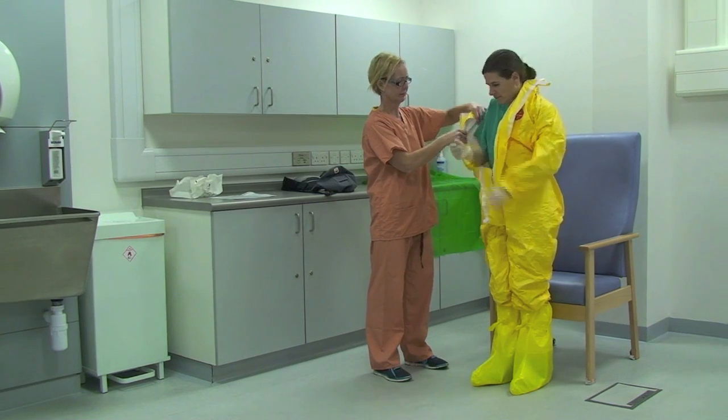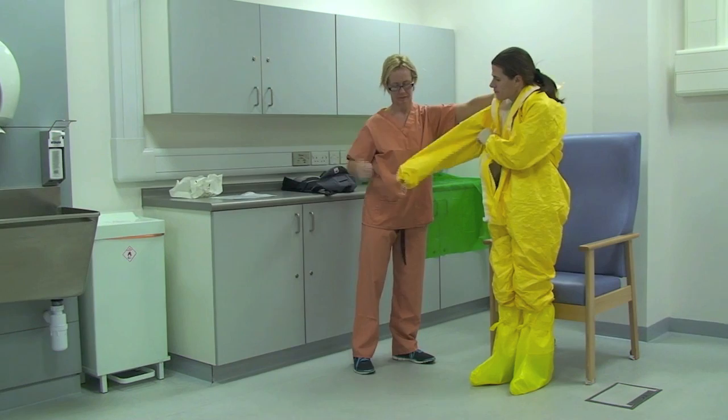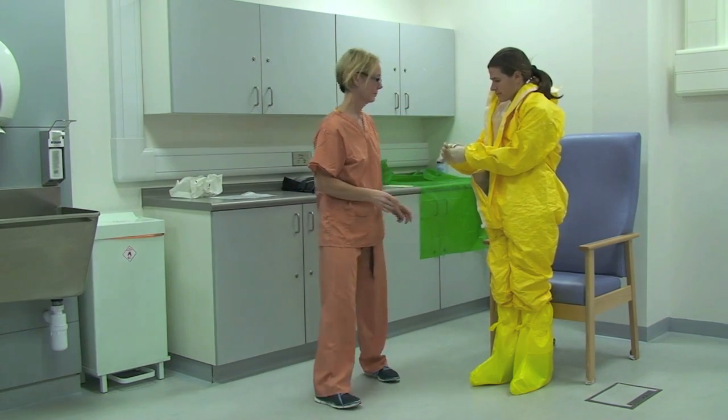The healthcare worker pulls the coveralls on. The buddy assists the healthcare worker to zip up the coverall, cover the zips and ensure the entire body is protected.